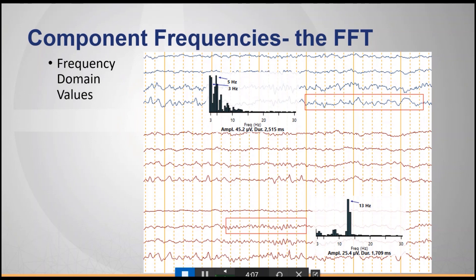In the segment below, using the same EEG but a different channel, the predominant frequencies are around 13 and 14 hertz. This corresponds to sleep spindles, which we can pretty clearly see in that channel.